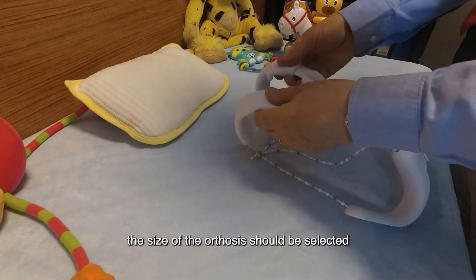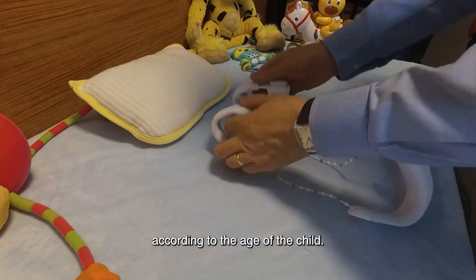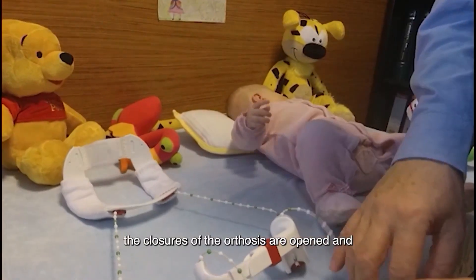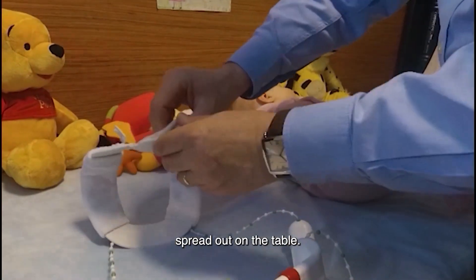First of all, the size of the orthosis should be selected according to the age of the child. Then, the closures of the orthosis are opened and spread out on the table.